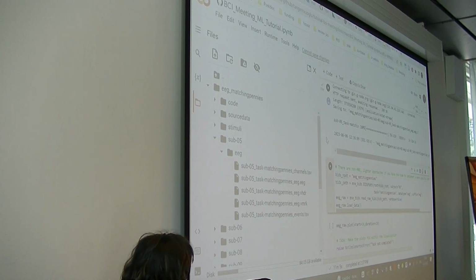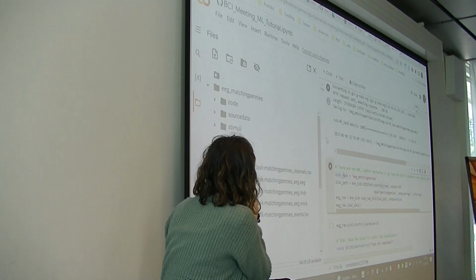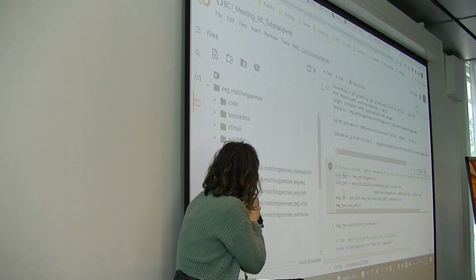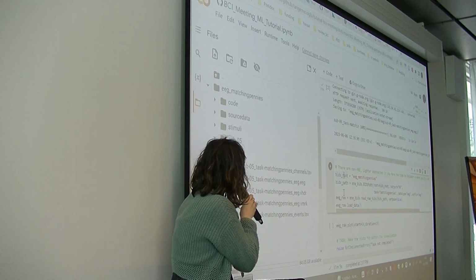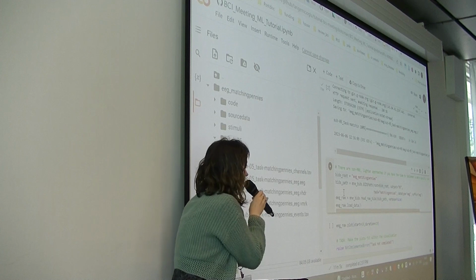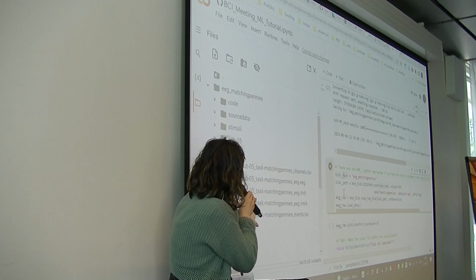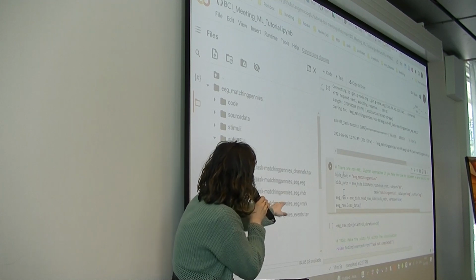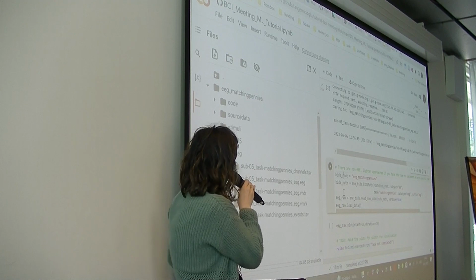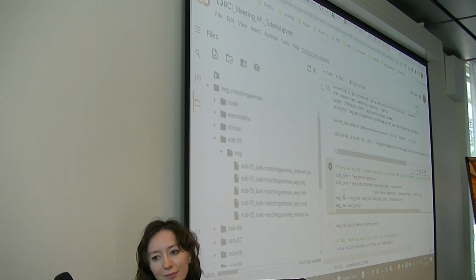And one more thing I wanted to mention about the BIDS, you can see a bit more how it's structured. So basically the file names are organized by having a meta tag. This stands for subject, then there's a dash and then the ID of the subject, underscore another meta tag, which is task, then the name of the task, underscore, and then it's either events or channels or electrodes or EEG. So again, a lot of structure in there on the meta level, which is really nice.